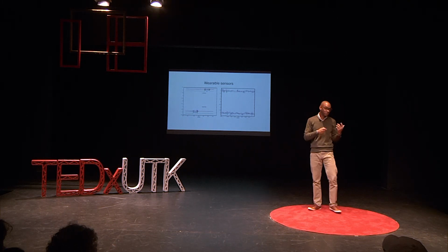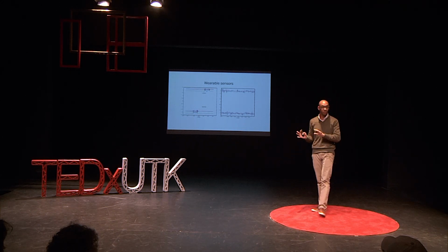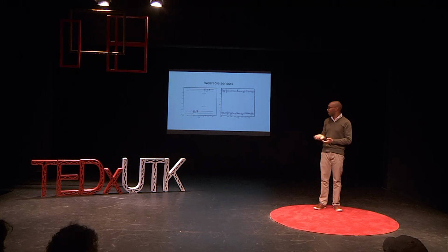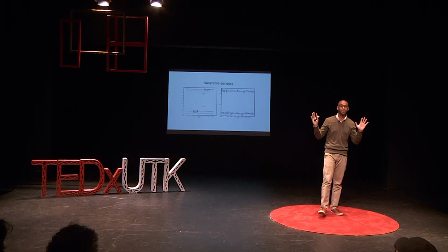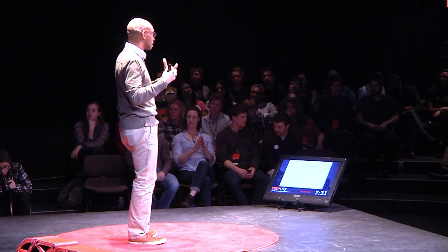However, if you send someone home with the sensors and ask them to do whatever they're going to do, it's a very different story. The plot on the right are data from the same individual wearing the same sensors at home, okay? Whenever I show this, I like to say to people, if you can look at that plot on the right and tell me what that individual is doing, then come work for me. I'll pay you lots of money right now, okay? Because it's a very hard problem to extract some type of meaningfulness from these raw data.